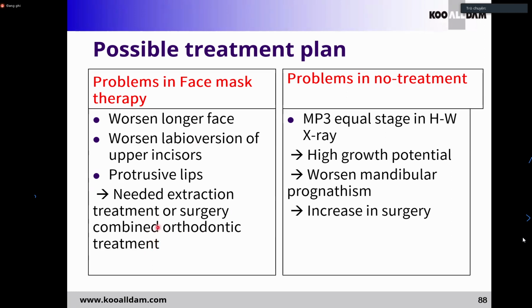These are the main problems in no treatment, just waiting. This patient is at the MP3 equal stage in the hand-wrist radiograph. This means high growth potential and worsened mandibular prognathism. So it may increase the need for surgery.